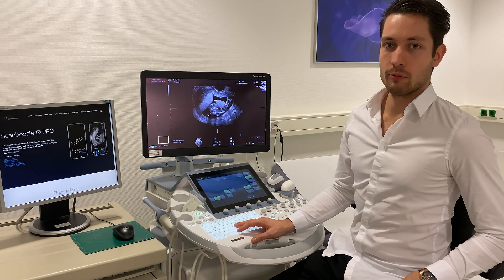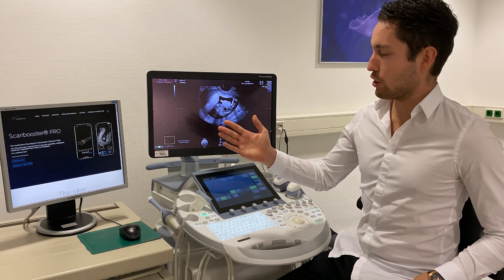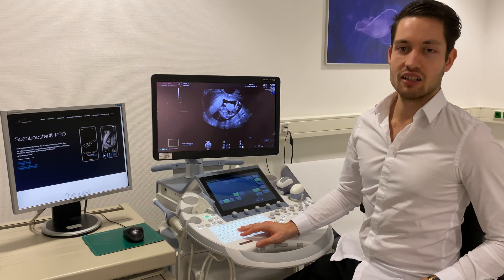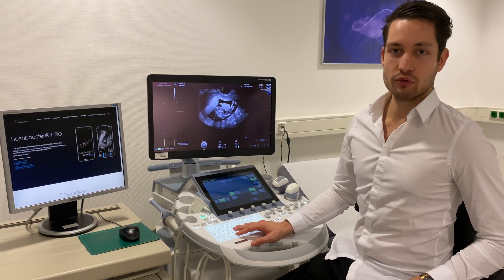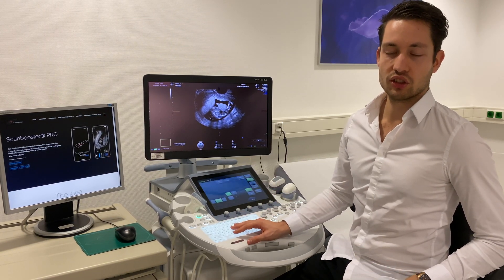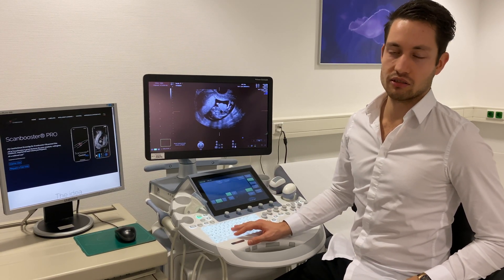With ScanBooster, I have access to a very large array of patient cases I can choose from, and I can instruct my students on any of those cases individually. When the students share their screen, I can give them individual help on how to scan and how to find pathologies in real time. Additionally, we have developed ScanBooster Pro, which allows universities, course providers and hospitals to access ScanBooster at a reduced price for all of their employees, students and course participants.